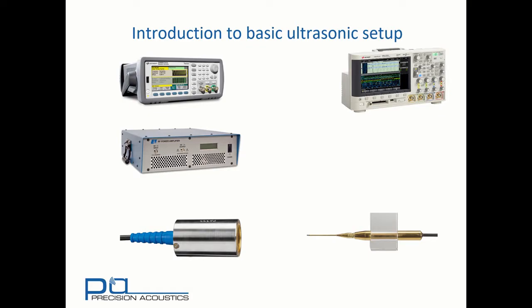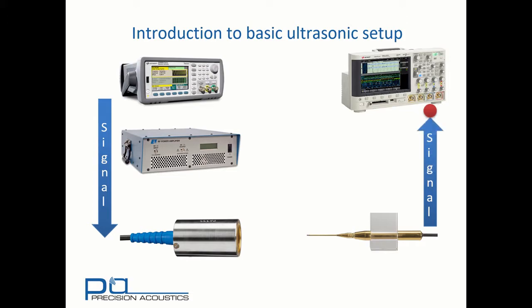It's convenient, both from this tutorial's point of view and in practice, to follow the signal chain from one device to another. We should be able to follow the signal from beginning to end, and this is a useful fault-finding technique. Let's do that now. Signal comes out of the function generator through the amplifier into the transducer, where it propagates through the water, into the hydrophone, and out of the hydrophone into the oscilloscope.